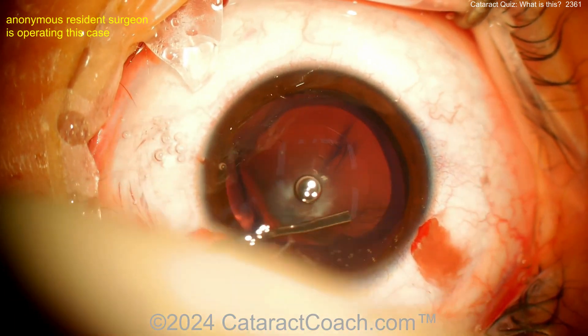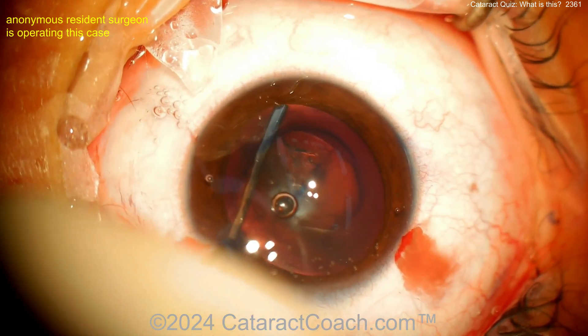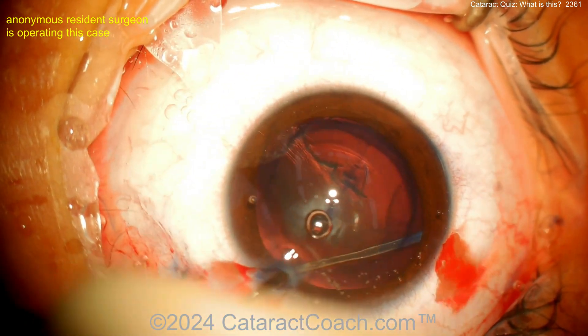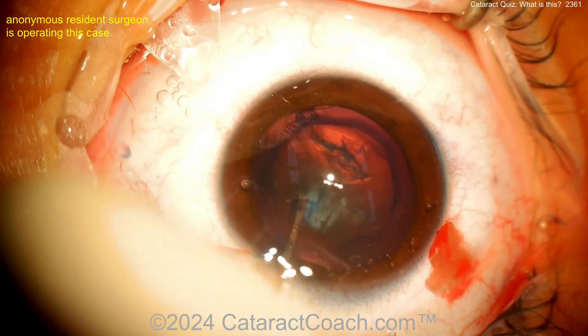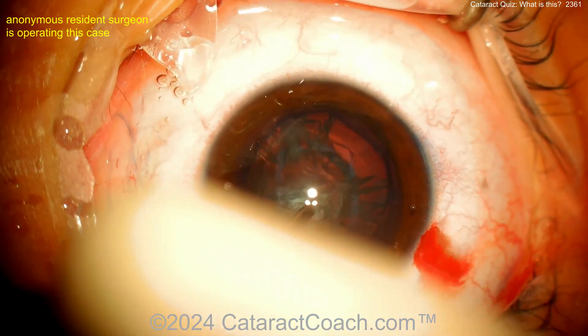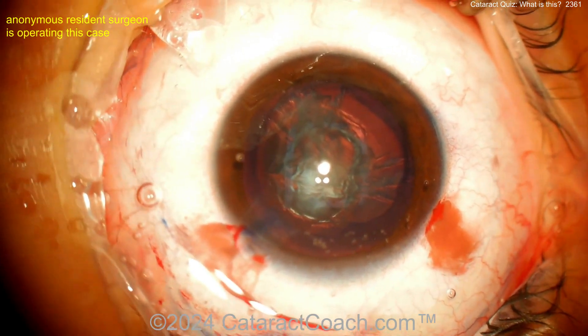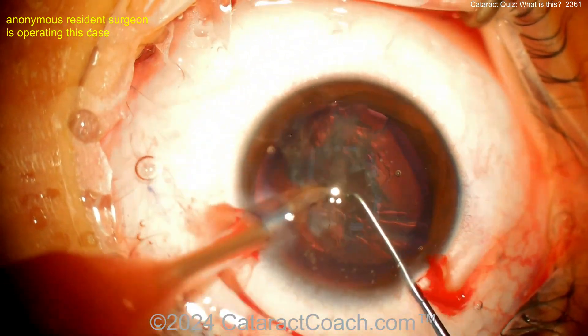A lens that looks this soft can be easily aspirated with the bimanual IA — you certainly don't need a phaco probe. Plenty of hydrodissection is a good idea. But the question is: what was that opacity on the posterior capsule — is it behind the posterior capsule? Is the capsule weak at that point? The way the surgeon is operating, you're probably guessing there's no weakness there at that spot.